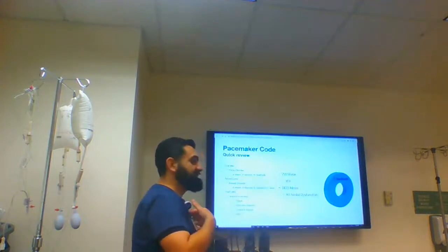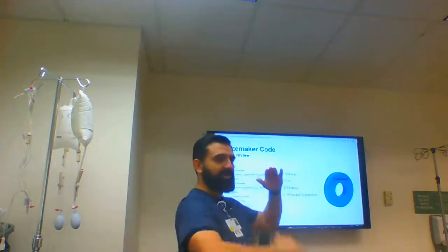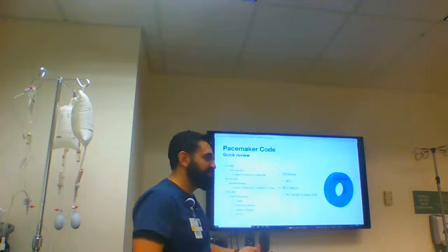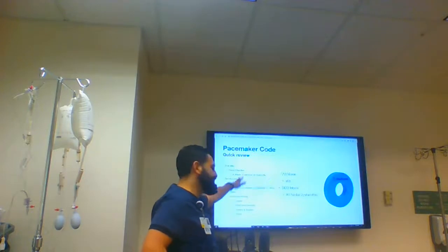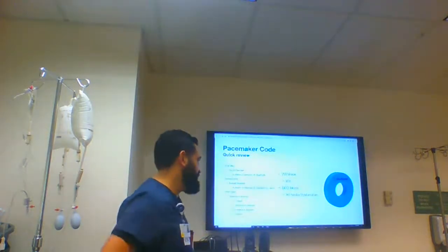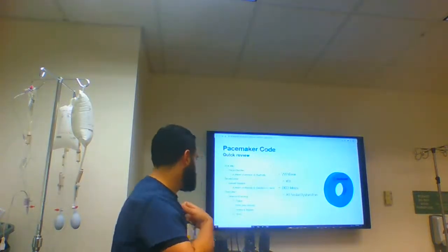If my pacemaker detects that I give a beat at 80, it won't pace me. But if I drop below the 80, it will pace me. That's what's on demand, because since it's not detecting my own beat, there's no need to inhibit, so my body's asking for it. So that's when the demand function comes in. It's only demand is based on what your heart needs.